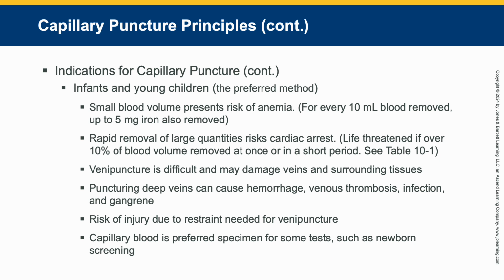Look at the caution in your textbook. It says capillary puncture is generally not appropriate for patients who are dehydrated or have poor circulation to their extremities from other causes, like if they are in shock, because sometimes the blood may be hard to obtain and may not be representative of the blood throughout their body. So you've got to keep that in mind also.